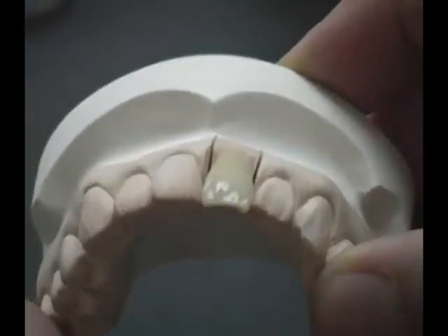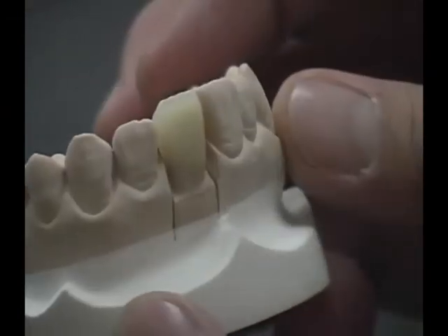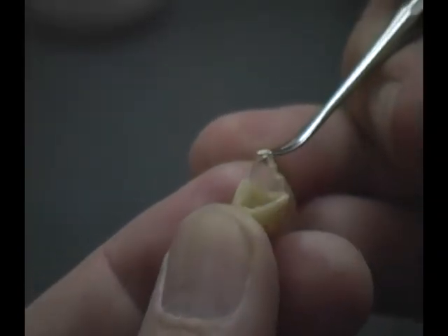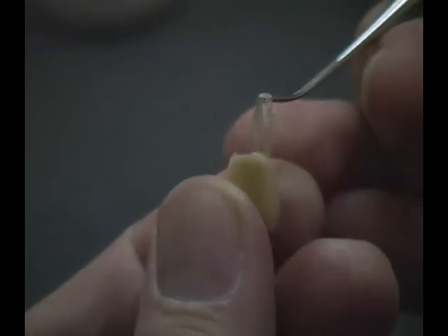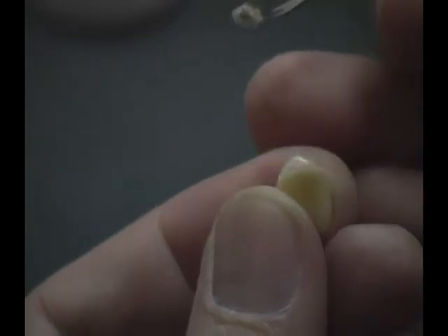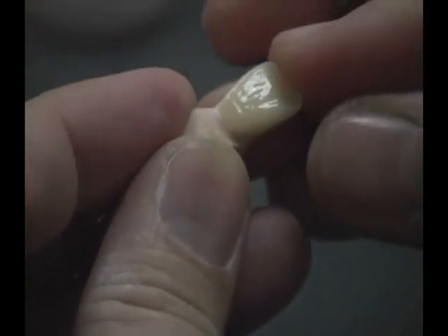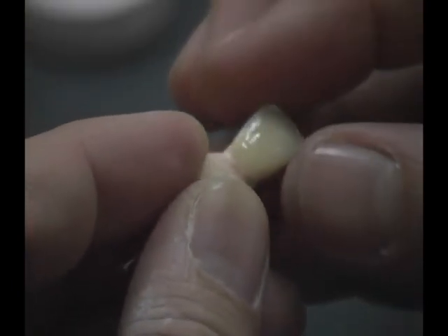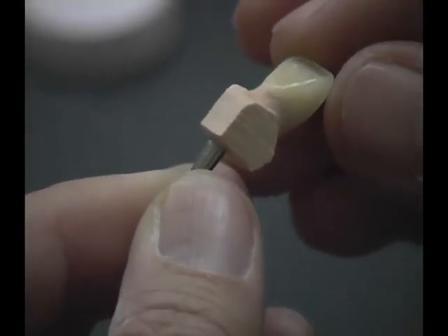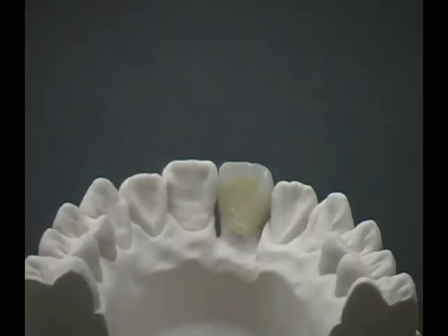The completed restoration with porcelain-like aesthetics and natural translucency. Separate the single crown from the die and remove the spacer easily. Place the crown back on the die to confirm the margins. The dentine and enamel can be clearly demarcated, similar to natural teeth, with a glaze-like final polish.